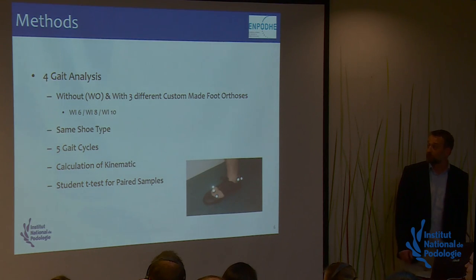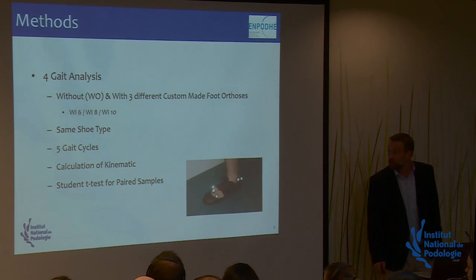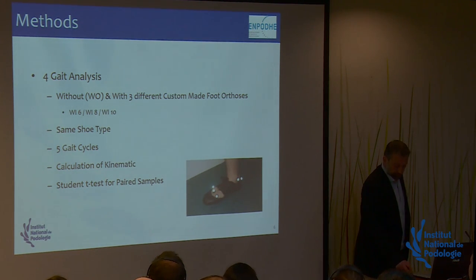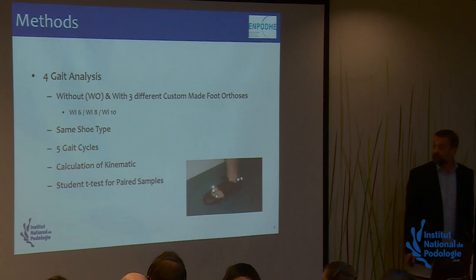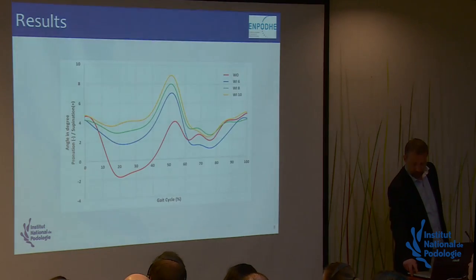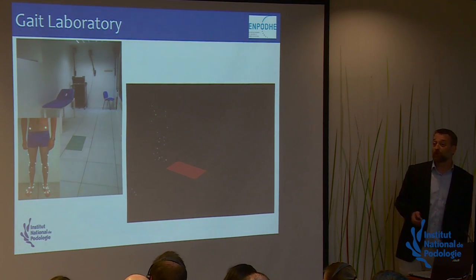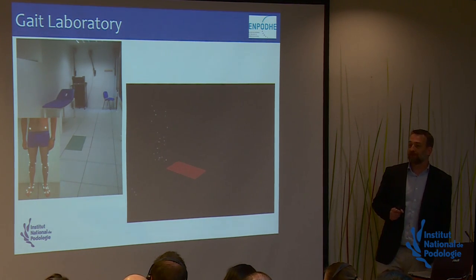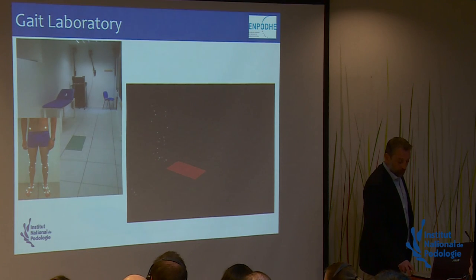All patients had the same shoe type. The main characteristic of the shoe is that there is no drop, no difference between rear and front of the shoe. We made a 5-gait cycle, a calculation of kinematic, and a Student t-test for paired samples. We made the motion capture here at the INP in the gait laboratory. We made obviously the same thing. So, what are the results?